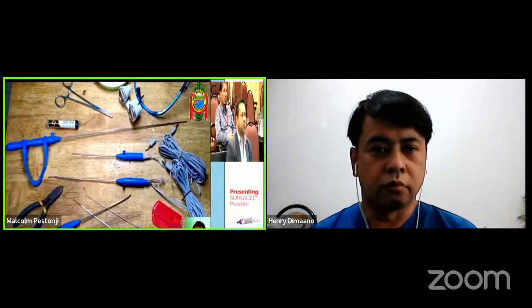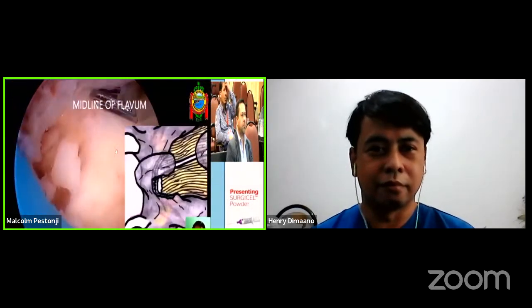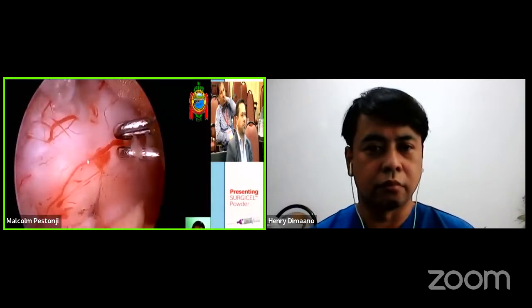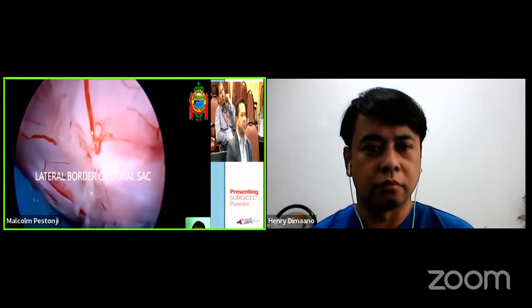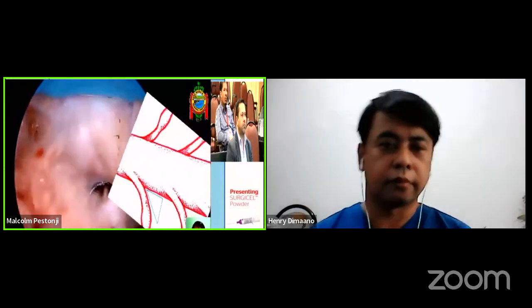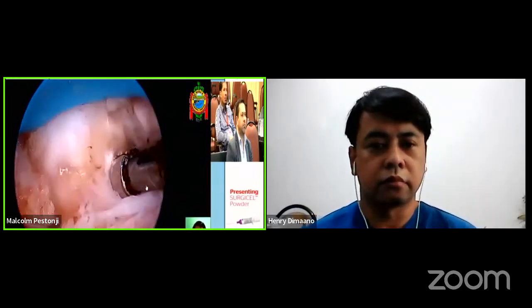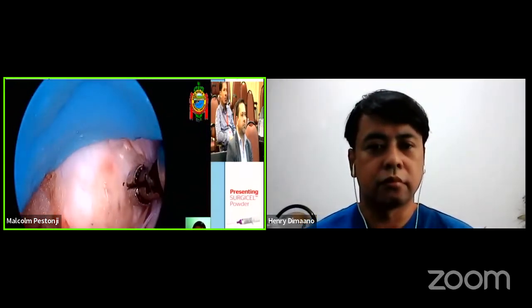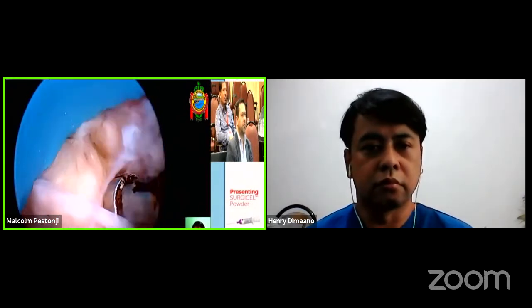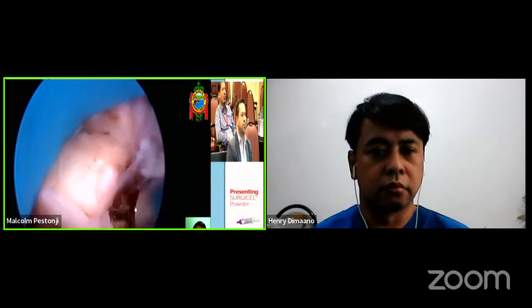This is a uniportal bipolar set, a long one. I've modified some of them to become shorter and therefore more compatible with doing biportal endoscopic work. You can see that here. It basically works the same way. Okay, this is a lumbar disc herniation, a big one, which I am going to slowly expose using this modified bipolar cautery tip, which came from a uniportal set. So it works the same way. Just made it shorter so that it's more comfortable to hold. There you go, that's your herniated disc.